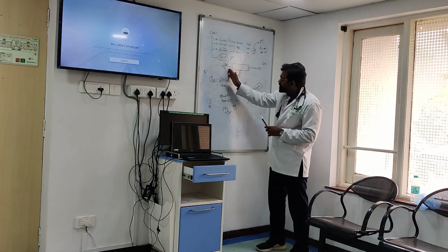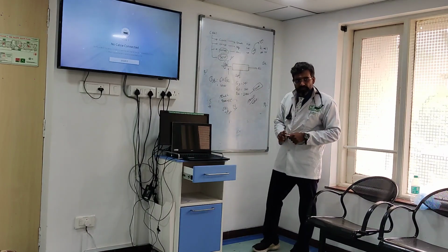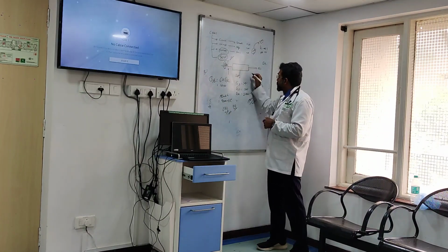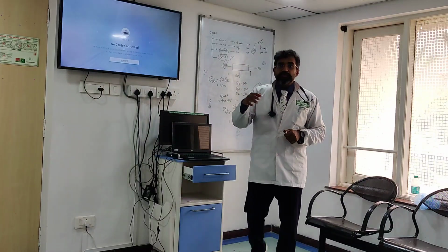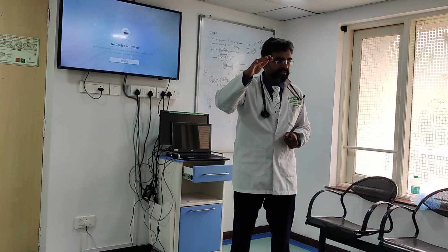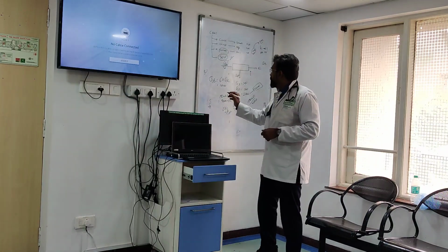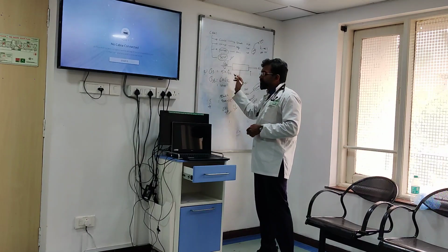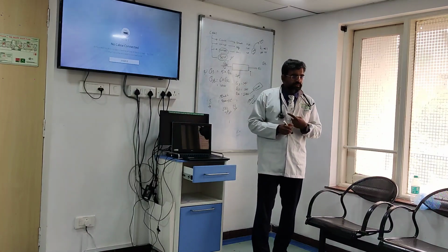When you do this same thing post-filter, we are doing this here, pre-filter. If by any chance you put this post-filter, we discussed, no? If you put it post-filter, the efficiency actually goes up a little bit. Since the efficiency goes up, what will you do with the blood pump? The blood pump now becomes QB = 5 × QR. You were asking this question sometime back, that's why I said.